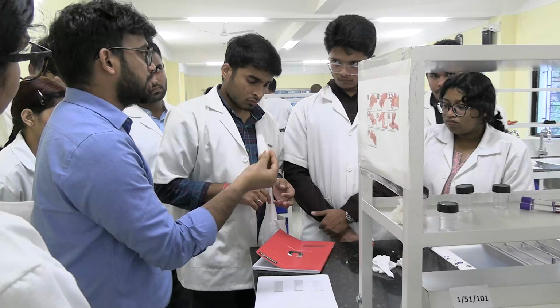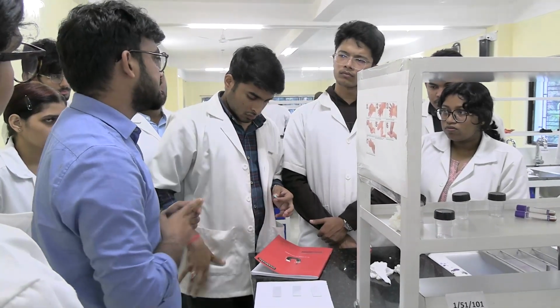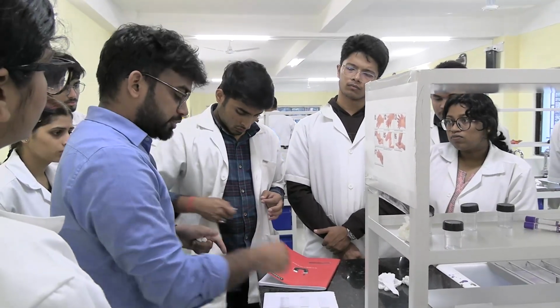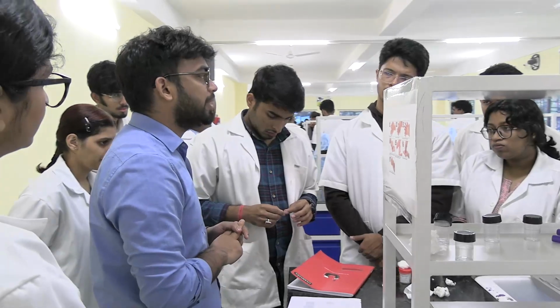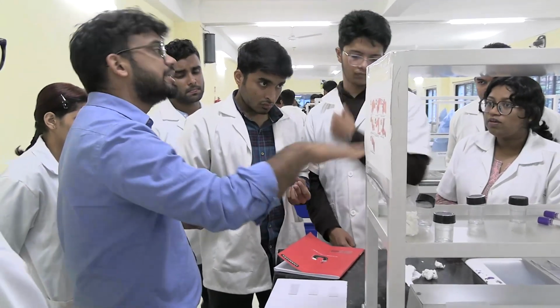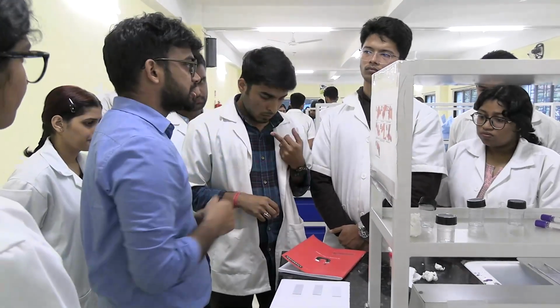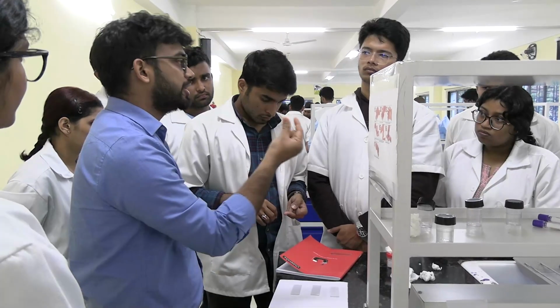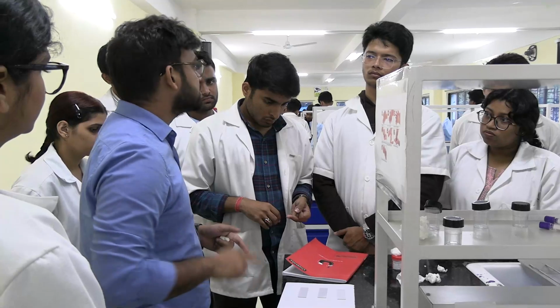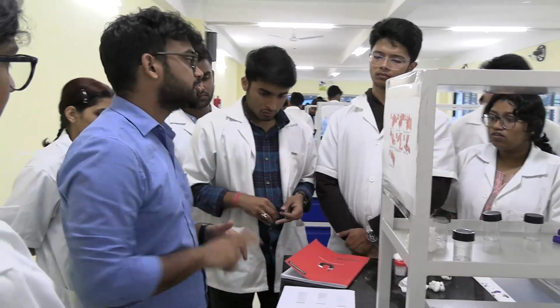And what if we give a big drop? Are you going to give a very big drop or a very small drop? If you are using a very big drop, the smear may not be single cell thickness. It will be a double layer, and it will also cover the entire slide. If the drop is very small, it will cover a very small area. The recommended area covered by a blood smear is 2/3 the length of the entire slide, about 4 cm.